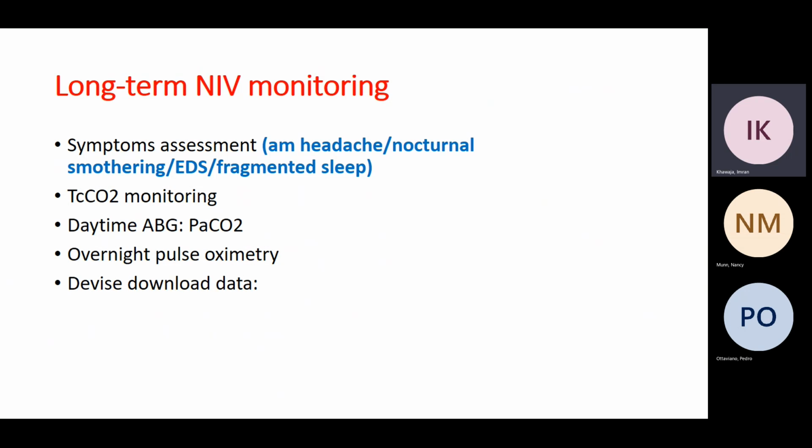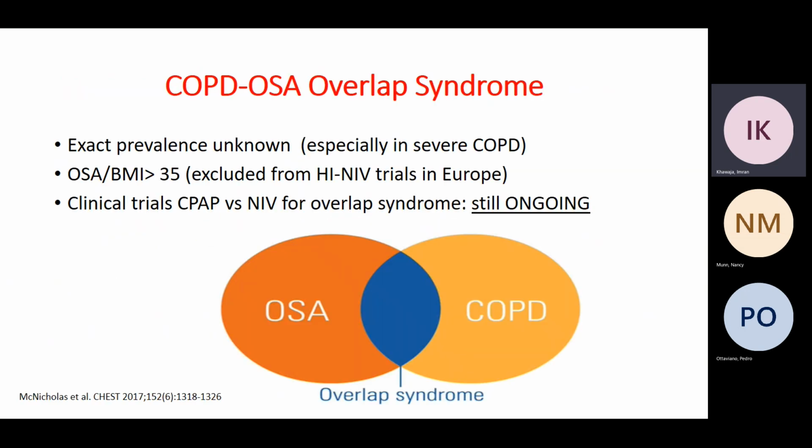The difference between your EPAP and your IPAP. So I know on consoles at Cabell, there's a really big push that if you do qualify them, they go with AVAPs. Nobody's going with BiPAP. I'll explain that to you, because unfortunately they just made it that way. Don't get me started on this. We'll come to this point. By the way, they pay more money for the AVAPs than for the ST, but the ST is for unique people.